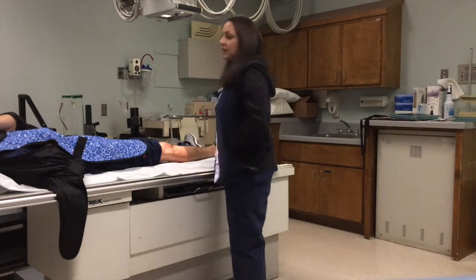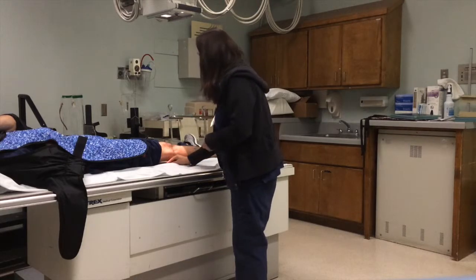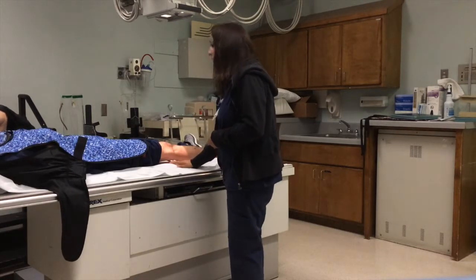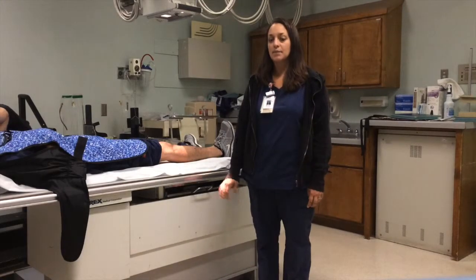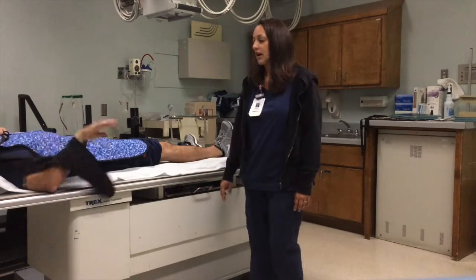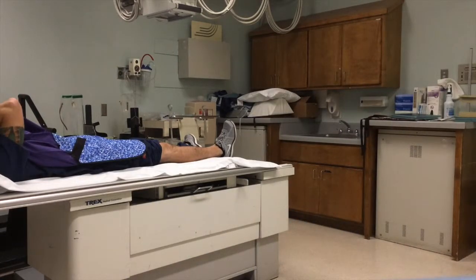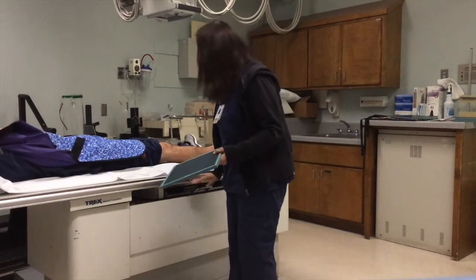There we go. I'm going to grab my right marker, put it on there on the lateral side. That looks great right there. All right, just hold still. My technique is going to be about, let's see here, 70 at 4, because I am in the bucky and I want it a little locked. Okay, just hold still. Beep. Okay.